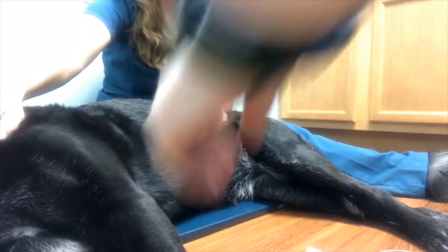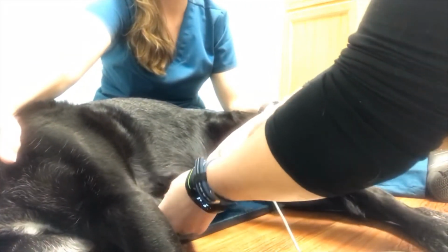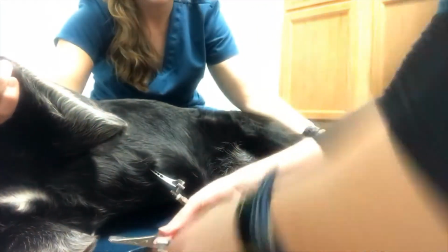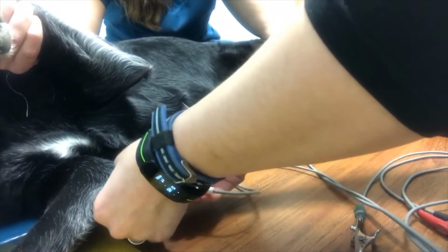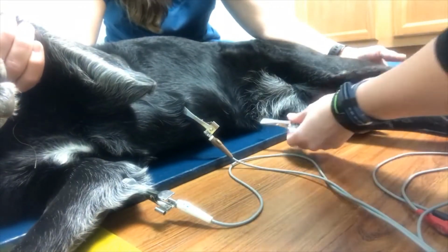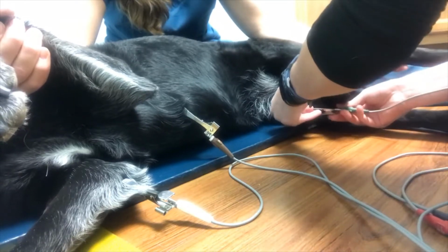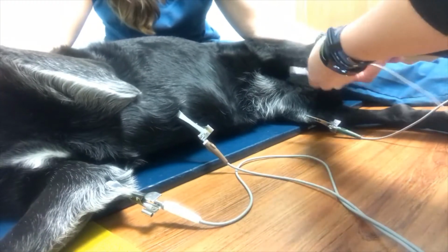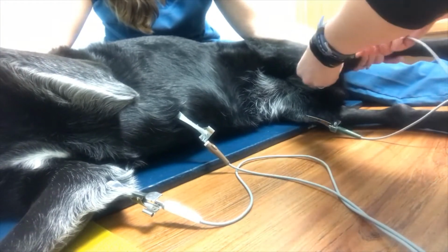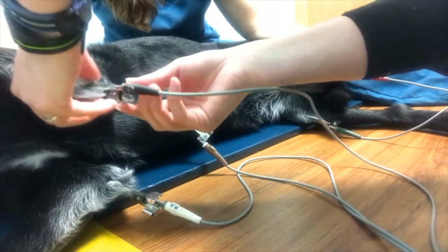The thing when positioning is that the legs are not touching. Put the ventral one here on our chest. So make sure I put the white lead on our right arm, just below the elbow here. The green goes on the right leg, just at the stifle. There we go. Smoke over fire, so the red goes back on the left leg. The black will go on the left arm.